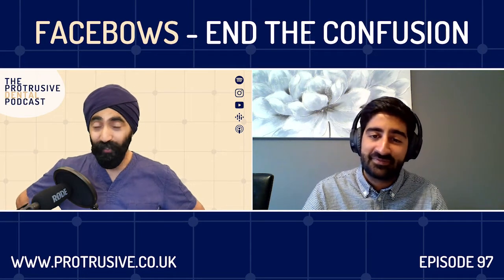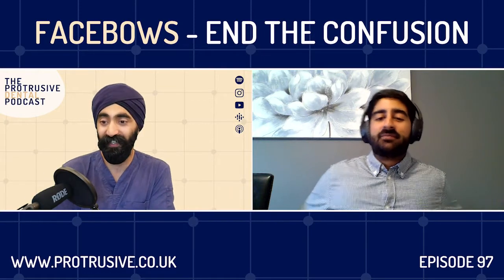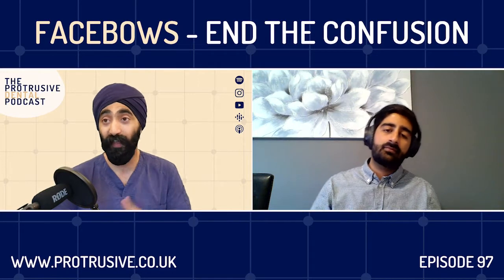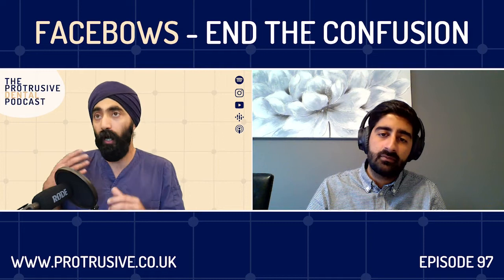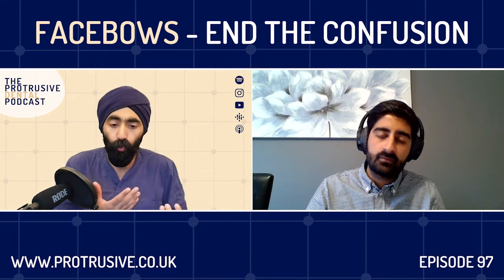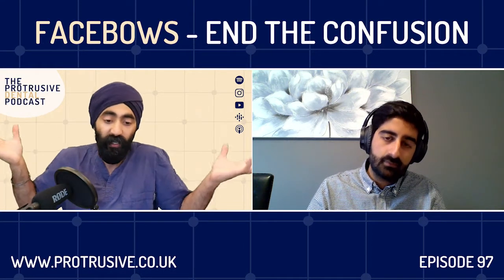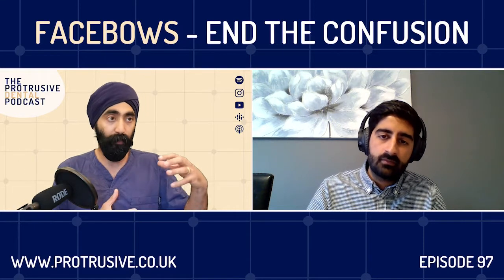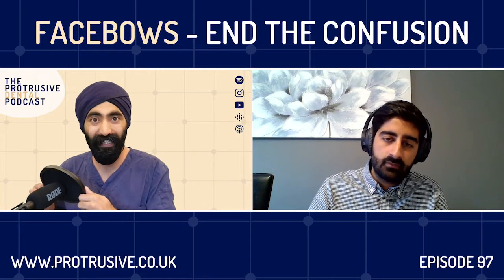Yeah. I'm so glad you said that, because I was waiting for this, and then you said it. As Tiff Qureshi taught me many years ago, the best articulator is a patient's own TMJ. And then you raise a great point. Look, as dentists we start using these tools, because all it is is just tools, right? Articulators, Facebow, it's just tools to help us to do less adjustment in the chair on the day of delivery. That's essentially, in a nutshell, all it is, to help reduce appointment times, to make sure that we and the technician can work together to do less work, make it easier for us, right?